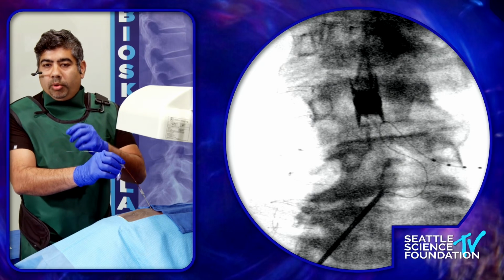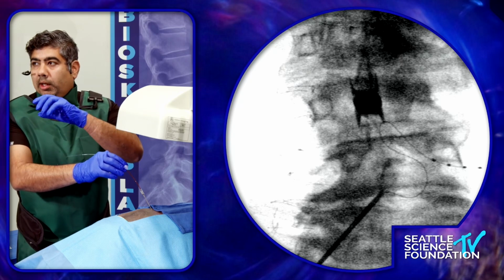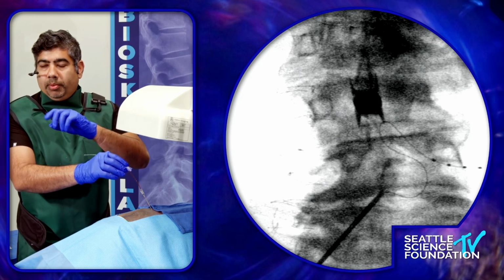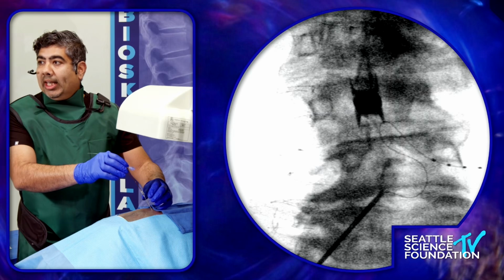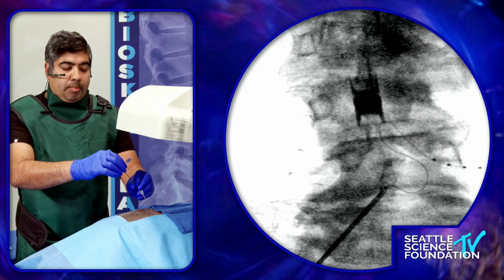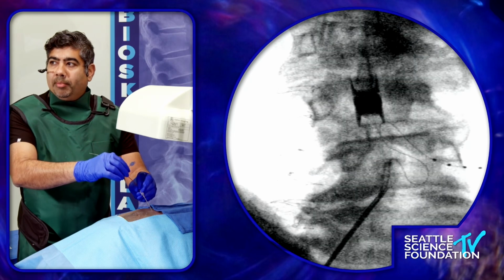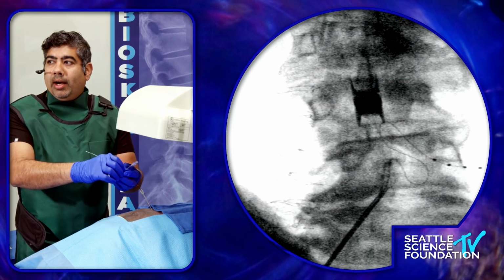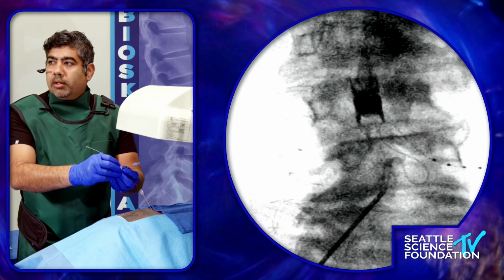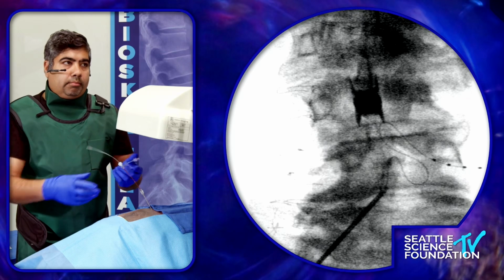Now, we did the top loop, we did the bottom loop, but that's not enough. In order to balance the force of the vectors acting on the top and the bottom loop, I need to form a secondary small loop so that I complete the S-curve of my stabilizing loops. So I turn everything back to something around 10 o'clock, and I use my driver to my advantage. I'm going to use my driver to drive up the lead. How high should I go up? The secondary loop usually goes up to the height of the spinous process you see on that X-ray. And again, the job of the driver is done. So the driver basically comes back, and I stabilize the lead, and your case is done.